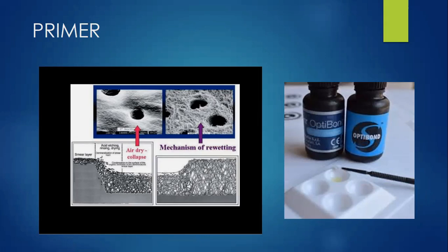For the etch and rinse technique, the wet bonding technique is recommended, more so when an acetone-based primer is used. As we said, the solvent in a primer can be acetone, ethanol, or water. When it is acetone-based, it is very important to have a wet bonding technique, because acetone is not able to establish hydrogen bonds and encourage collagen re-expansion. Even excess water should be removed with a dry sponge. It should not be there. How moist the dentin should be is an ambiguous concept, but it should not be over-dried, and it should not be over-wet.